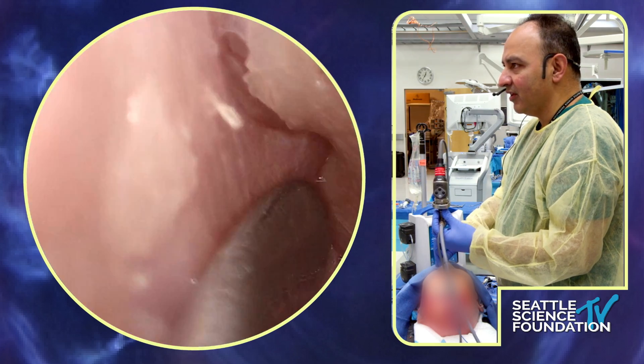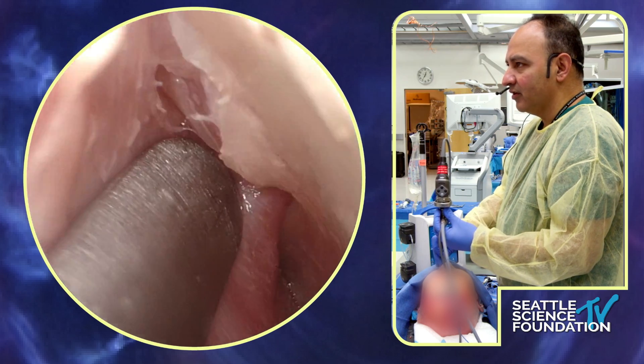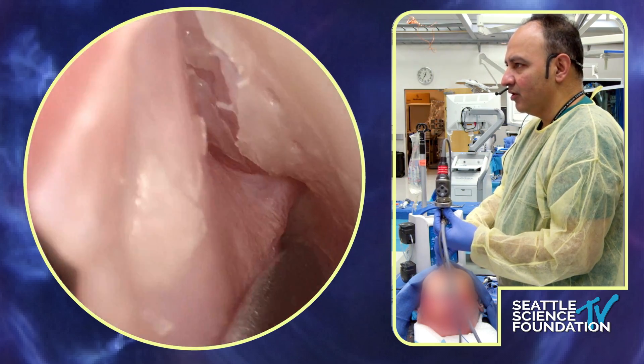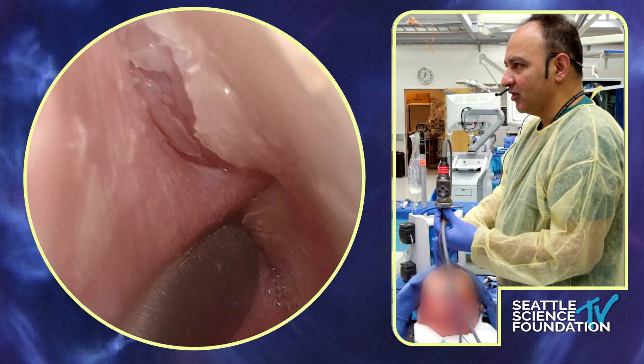And behind that prominent bone we'll find the sphenopalatine artery right there in position. Once you've found it, you have a lot of options. You could use monopolar — I don't love that. My favorite is using bipolar in here, but you can also use clips.